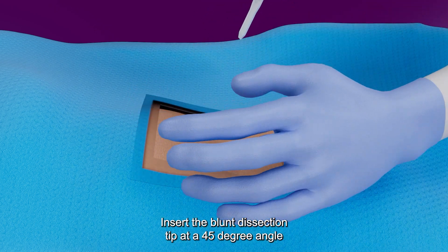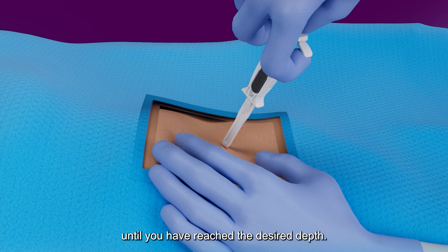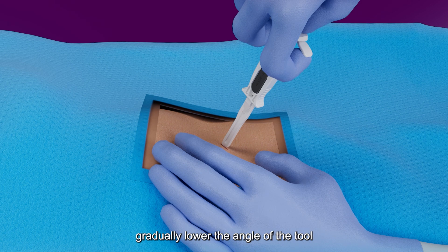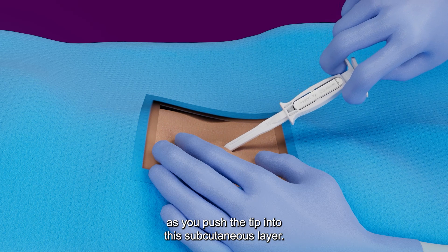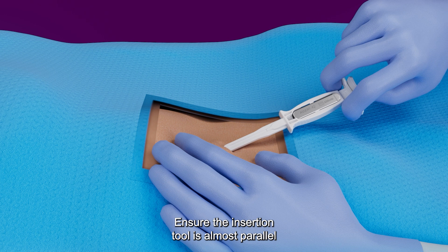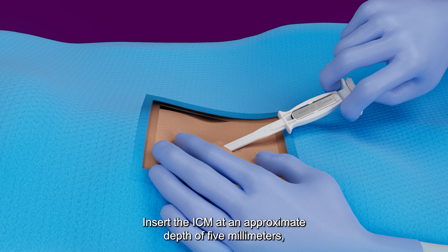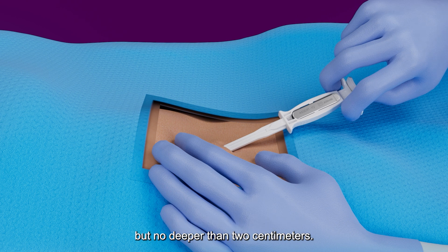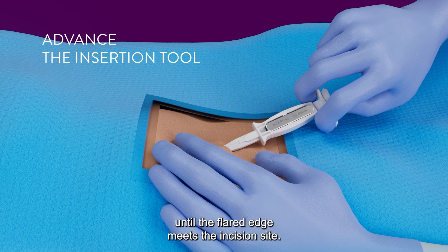Insert the blunt dissection tip at a 45-degree angle into the incision site until you have reached the desired depth. Once you have reached the desired depth, gradually lower the angle of the tool to approximately 10 degrees as you push the tip into the subcutaneous layer. Ensure the insertion tool is almost parallel to the patient's chest at this point. Insert the ICM at an approximate depth of 5 millimeters, but no deeper than 2 centimeters. Advance the insertion tool until the flared edge meets the incision site.